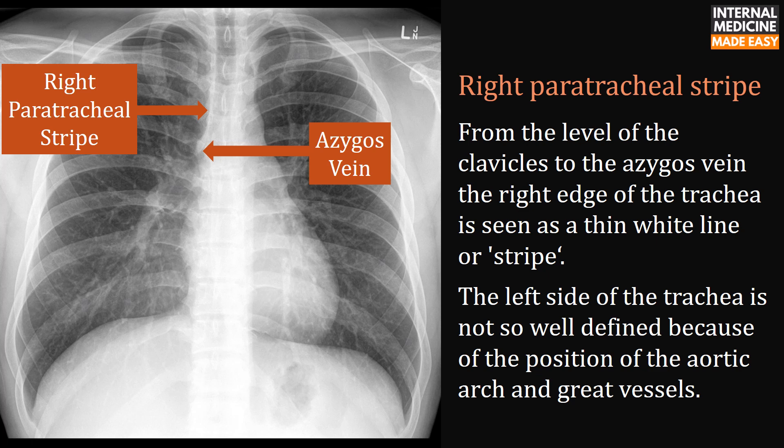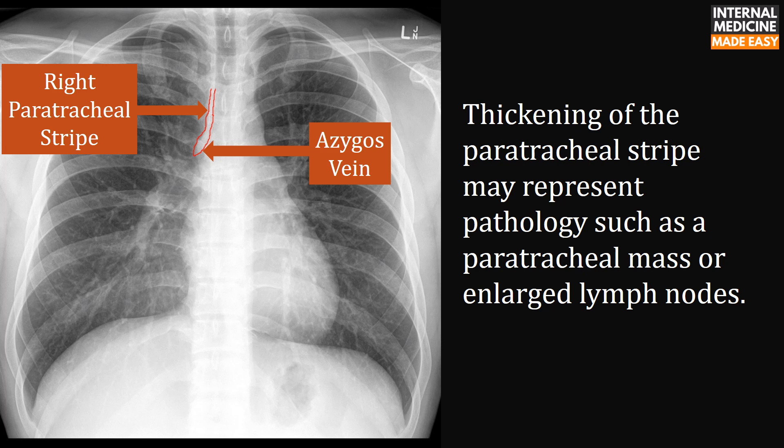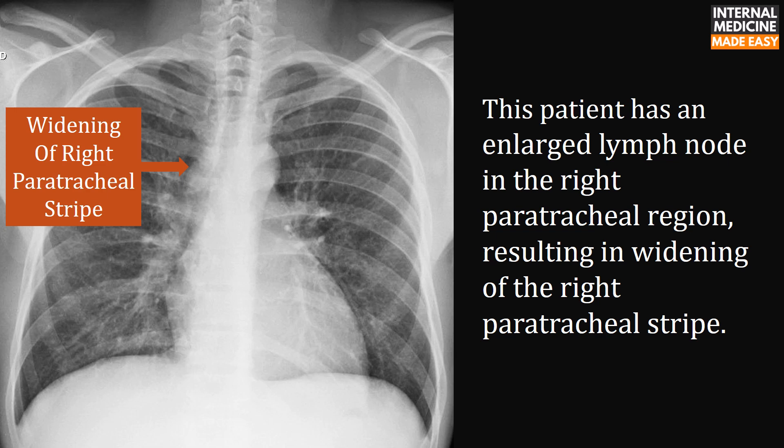The right paratracheal stripe: from the level of the clavicles to the azygous vein, the right edge of the trachea is seen as a thin white line or stripe. The left side of the trachea is not as well defined because of the position of the aortic arch and great vessels. Thickening of the paratracheal stripe may represent pathology such as a paratracheal mass or enlarged lymph nodes. This patient has an enlarged lymph node in the right paratracheal region, resulting in widening of the right paratracheal stripe.